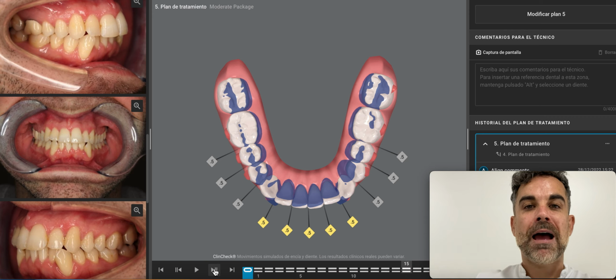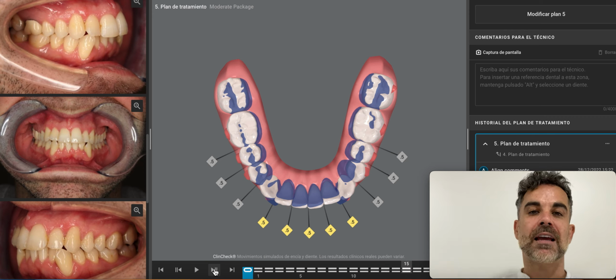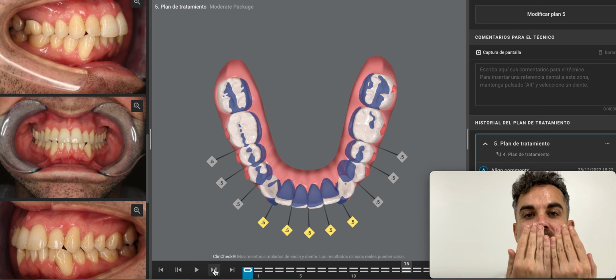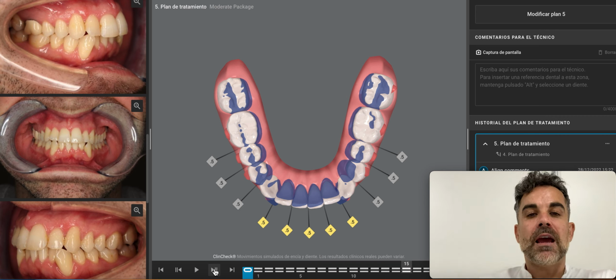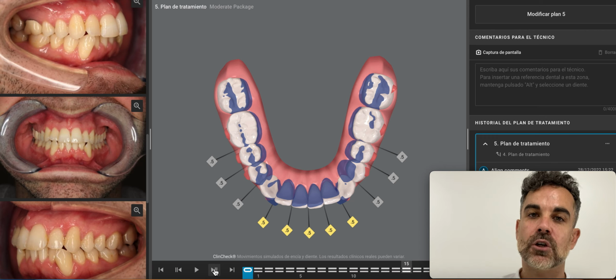First, we need to expand, then use the space that we have distal to the canines to align them. And when the contact points in between the lower incisors are okay, we perform the IPR, we do it in the clinic, and then we retrude. This is a round tripping, but incisors will only be proclined during a short amount of time.